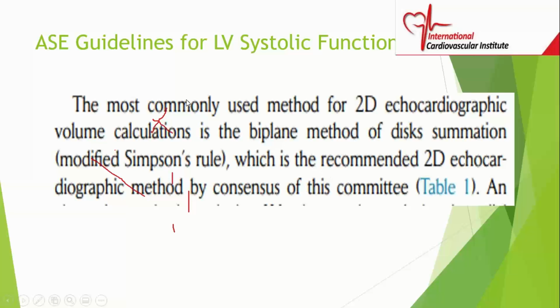As mentioned before, the most commonly used method for two-dimensional echo volume calculation is the biplane method of disk summation, or the modified Simpson rule. Again, people doing an exam, that's another question.